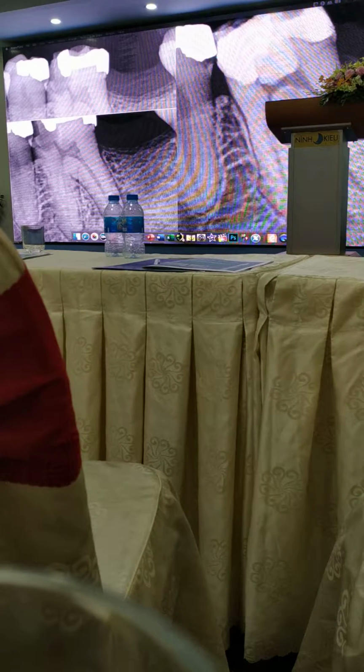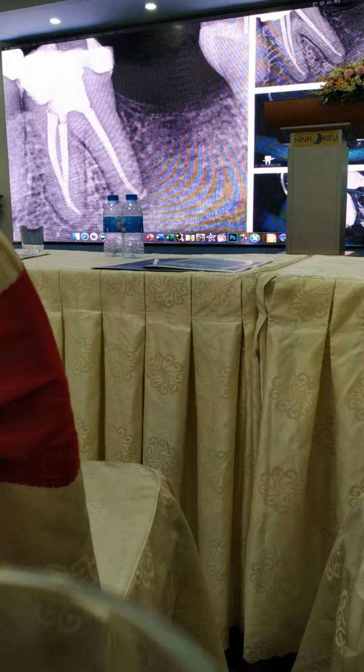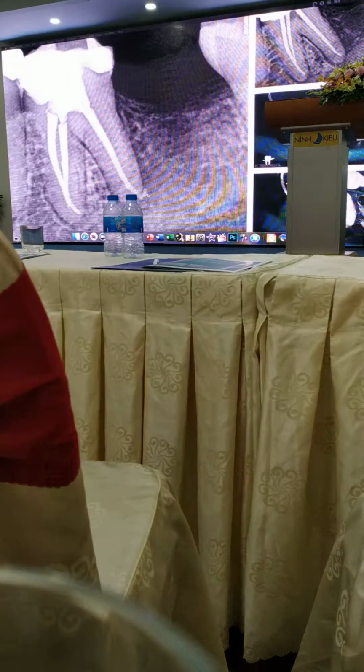This is just after the pre-endodontic core build-up, and this is our final restoration. I am not afraid of this puff because the material is really biocompatible.